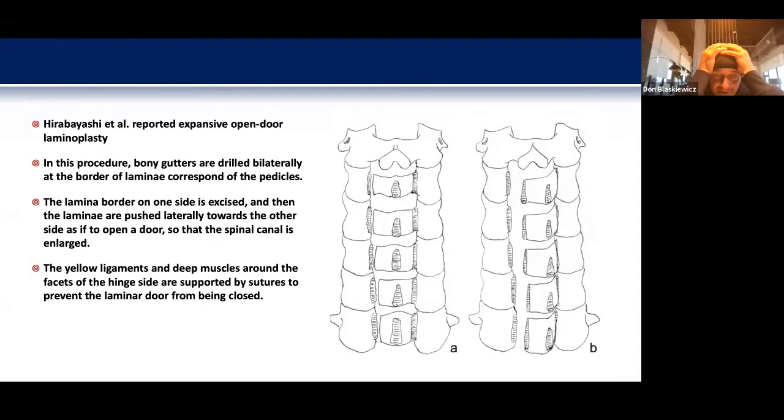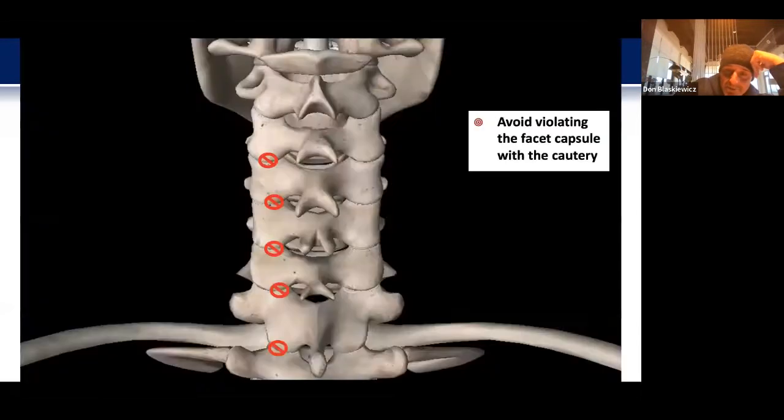On one side the trough is drilled down just to the inner cortex, and on the other side a complete cut is made. The ligaments around these can be sutured to keep it open, or nowadays we all have some version of plate or plate-and-bone-plug which are fixed onto the lateral mass and lamina to hold it open.